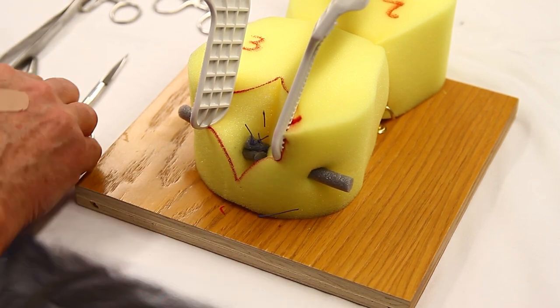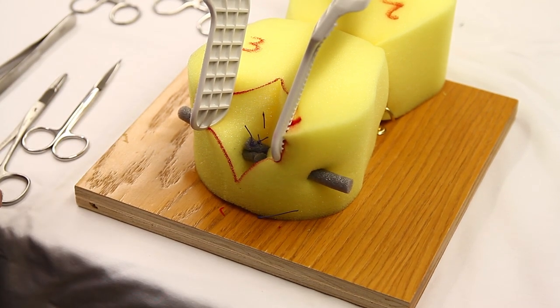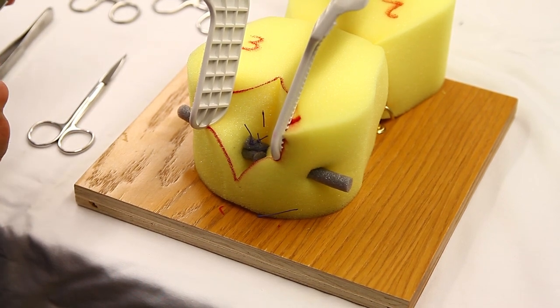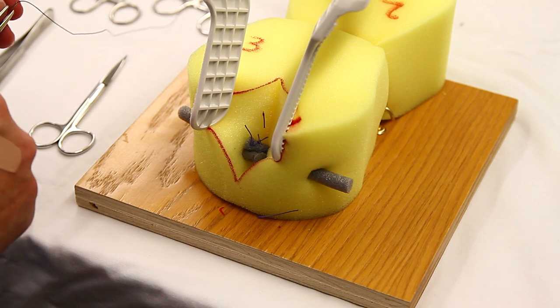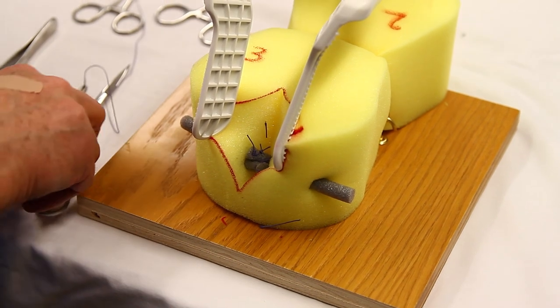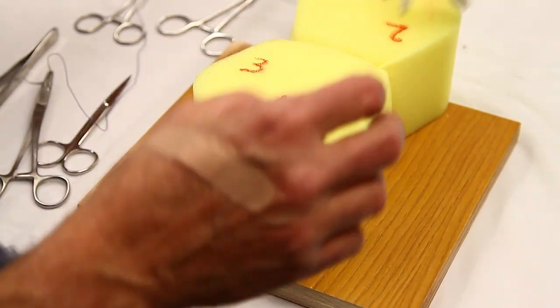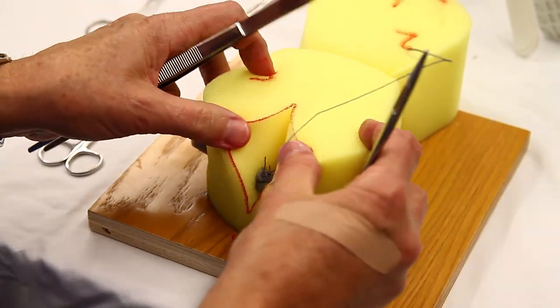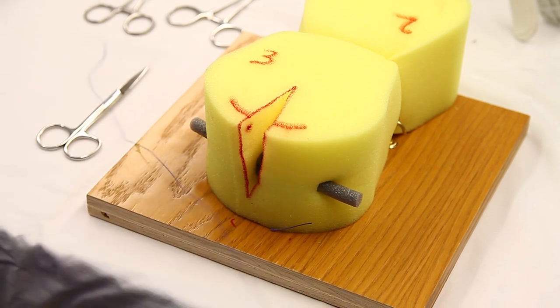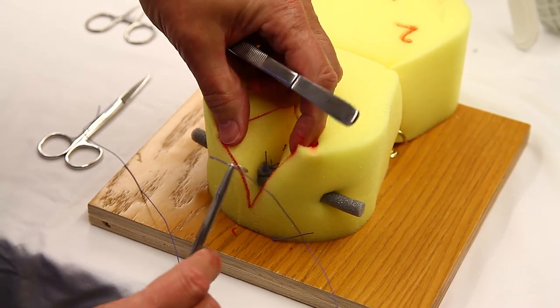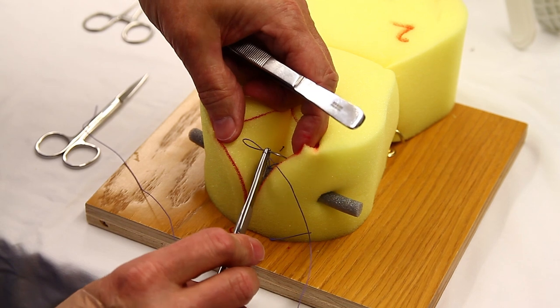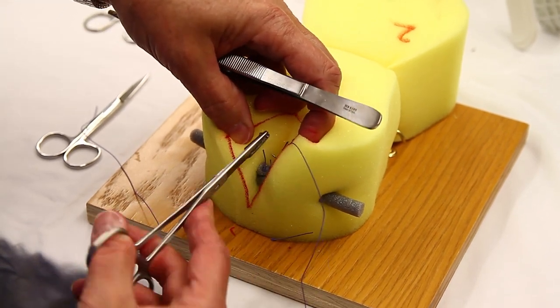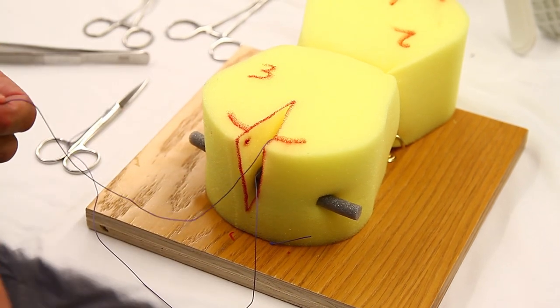The next step is to turn it into a vaginal laceration that resembles a second degree tear. So what you do is remove your retractors, let the tissues come together. And then what we want to do is with our same 2-O or 3-O vicryl, close the vaginal wall over that rectal repair. So we're going to have a set of deep sutures here.